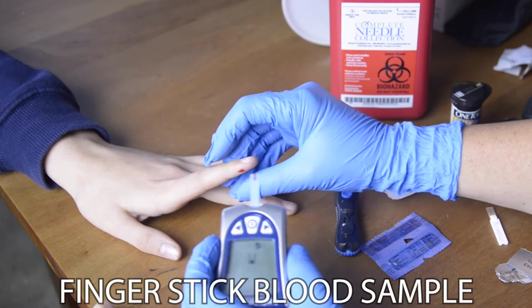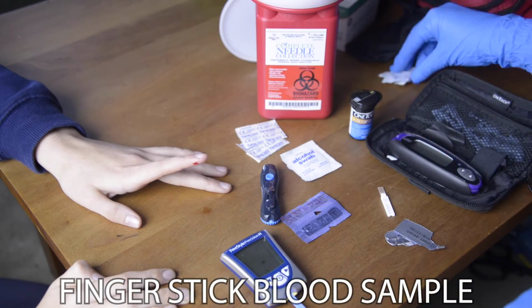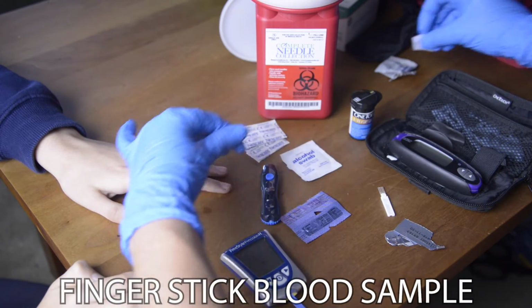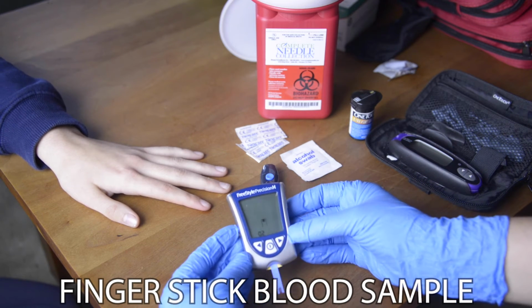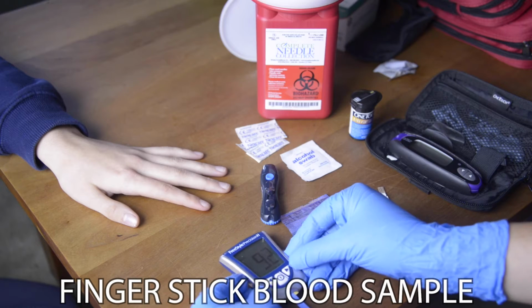So a properly calibrated meter. And we can wipe this and give them a Band-Aid if necessary to stop that bleeding. So they have a blood glucose of 92.